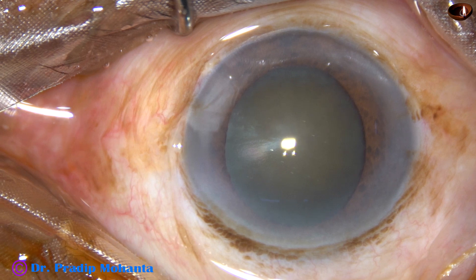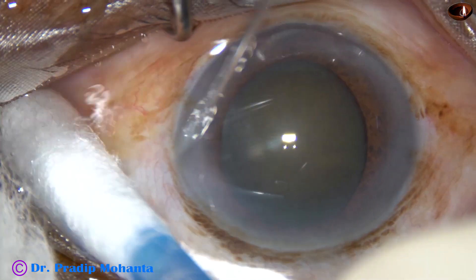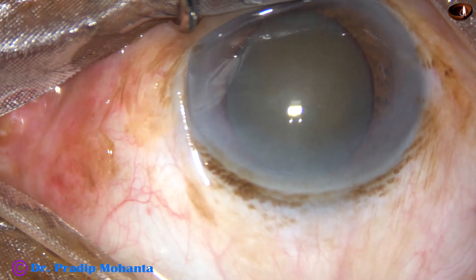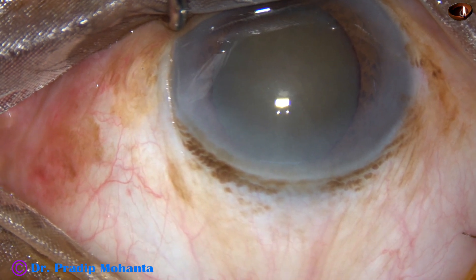We can see this is a hard cataract. The pupil has dilated quite well but not fully. The cataract is quite hard — nuclear sclerosis is about grade 3 plus or grade 4.